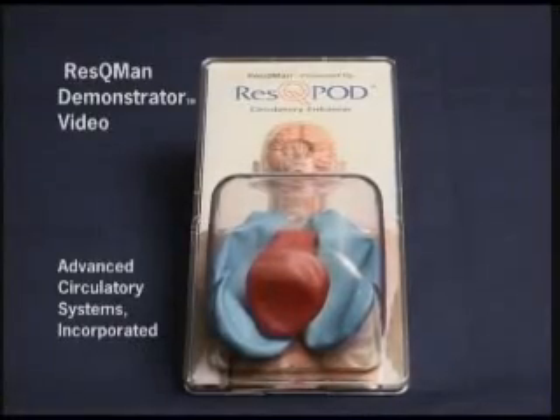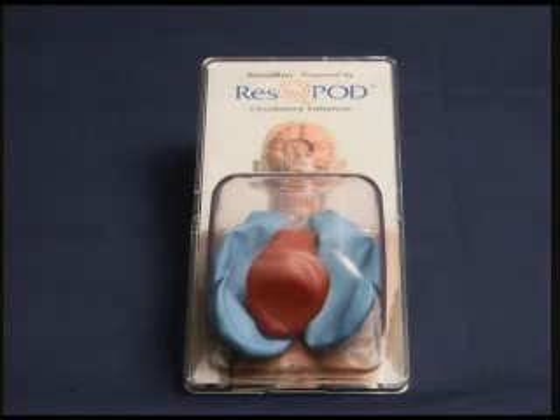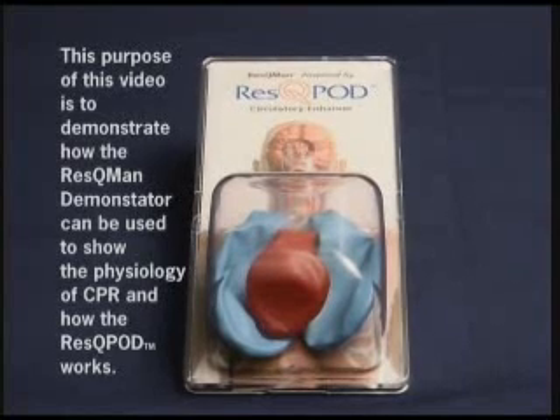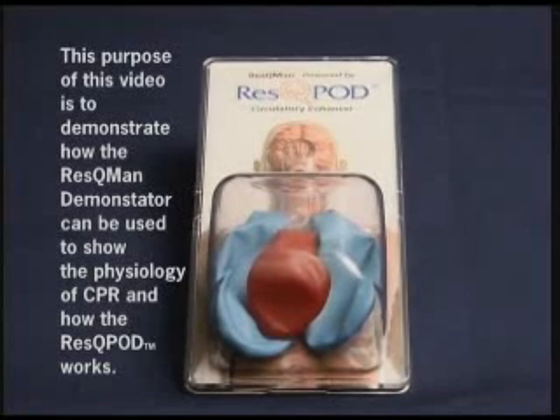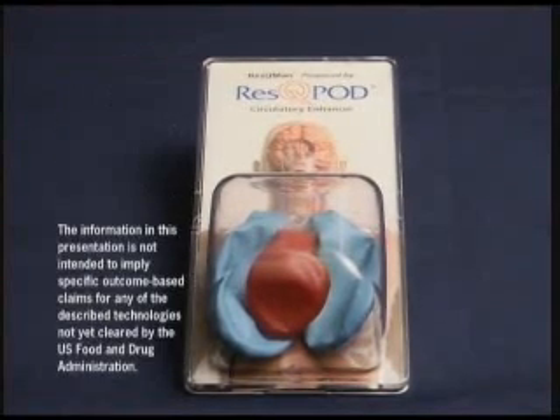The purpose of this video is to demonstrate the physiology of CPR using the Rescue Man demonstrator device. First, we'll talk about how CPR is performed with a pair of hands. Then we'll talk about how the Rescue Pod can be used to double the blood flow to the heart and the brain during CPR. Then we'll talk briefly about three common mistakes that can be made during the performance of CPR that we have to be careful to avoid.